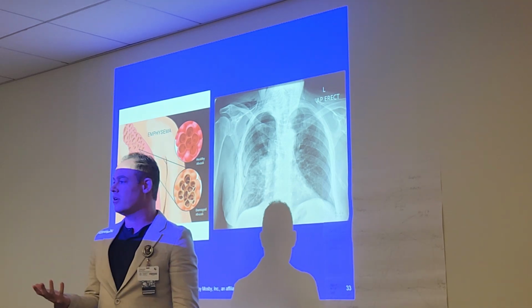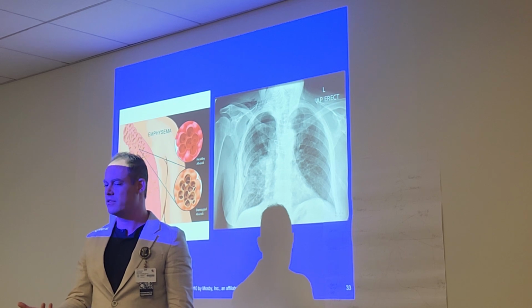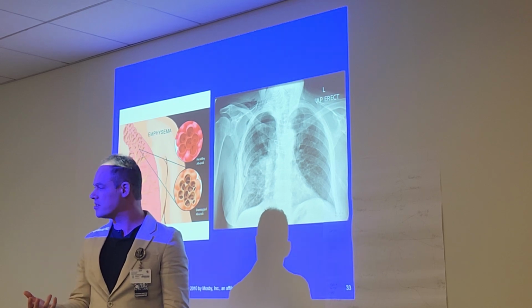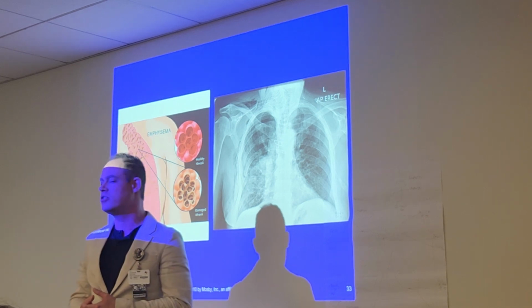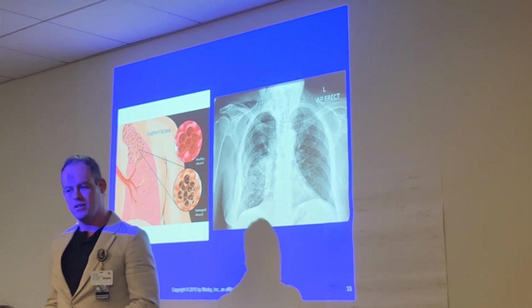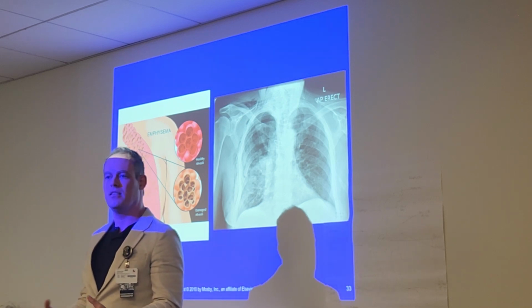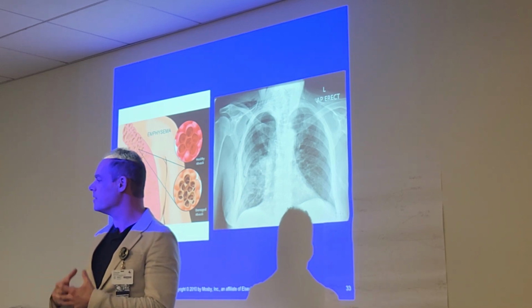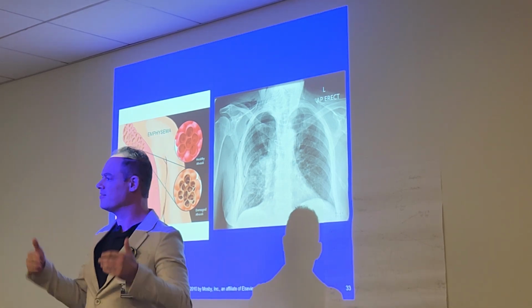Since I already said osteoporosis, if a patient has osteoporosis, the bones become what? Brittle. More fragile and porous. Therefore, if a patient presents with osteoporosis in their femur, what would you do with your technique? Decrease mAs. Why? There's less bone tissue. It's becoming more porous, more holey.